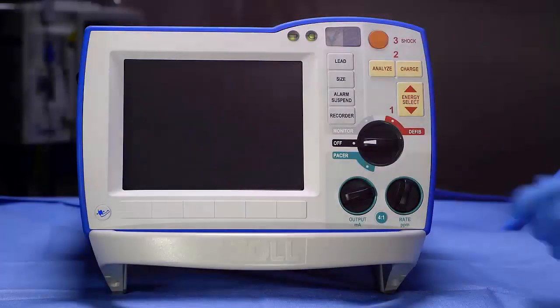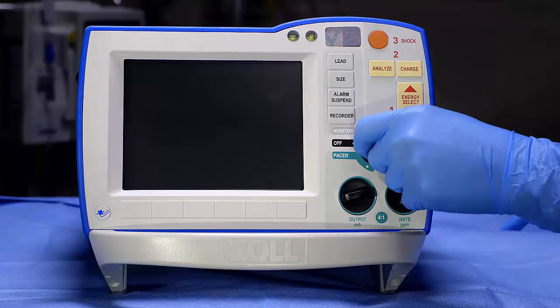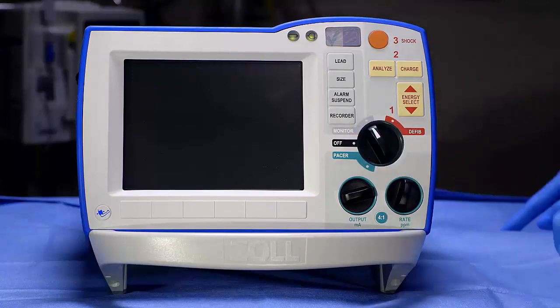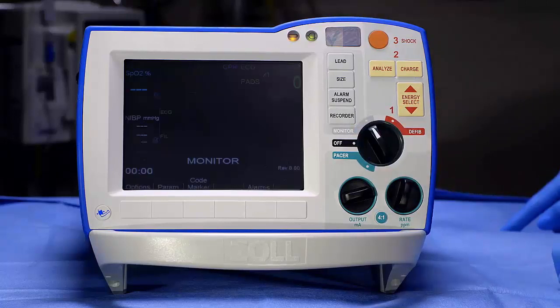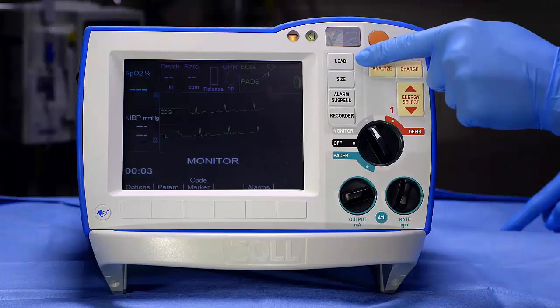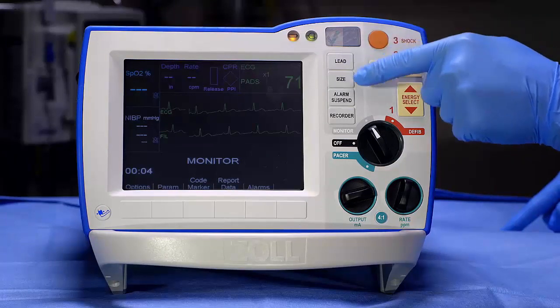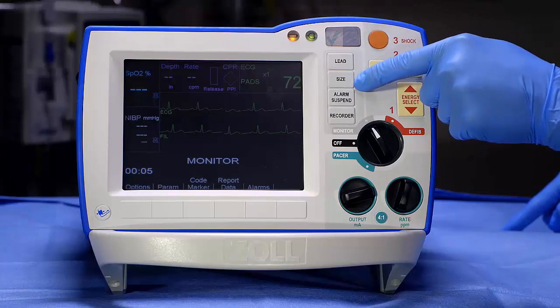To monitor your patient, turn the mode selector to Monitor. The keys in the gray area affect everything you see on the display. Press Lead to cycle through different leads, and Size to change the size.